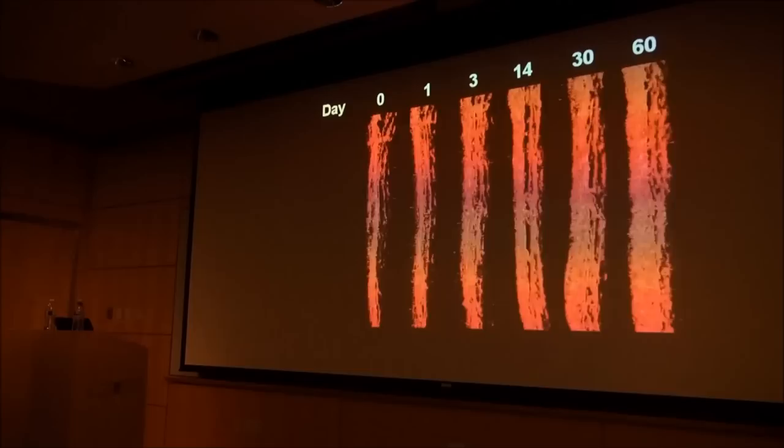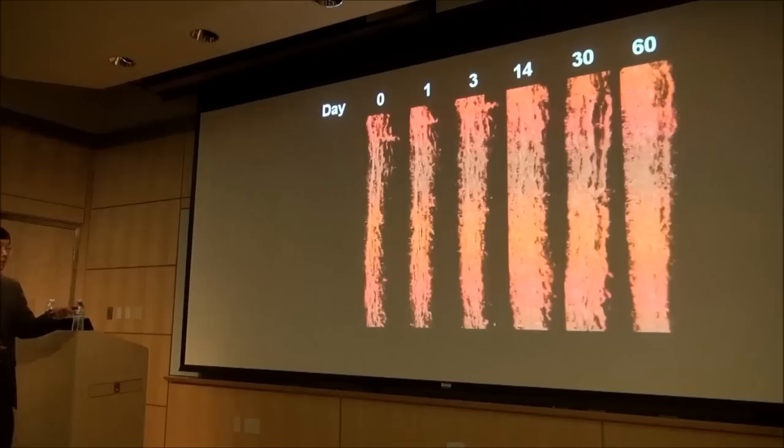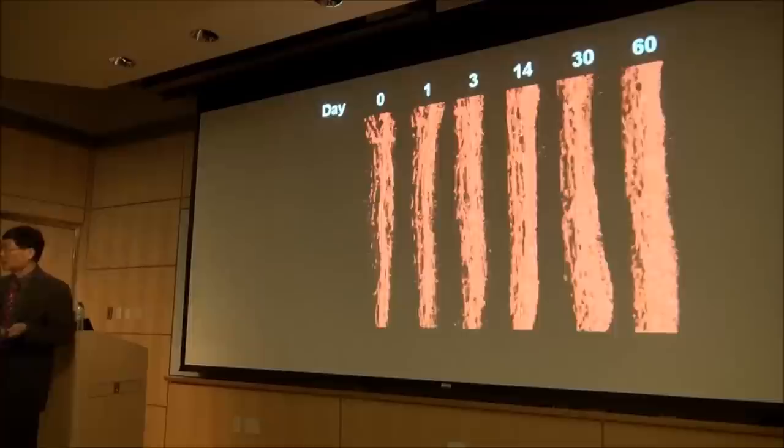So this is extremely powerful for basic research. We're working with our angiogenesis expert at Washington University. He had to sacrifice many animals if he wanted to get the same thing using invasive techniques. And he had to deal with intersubject variability.